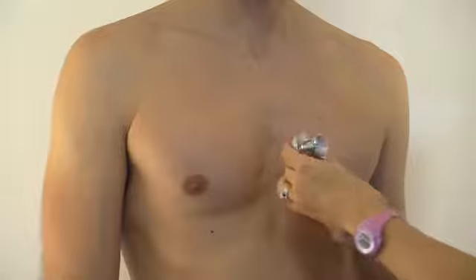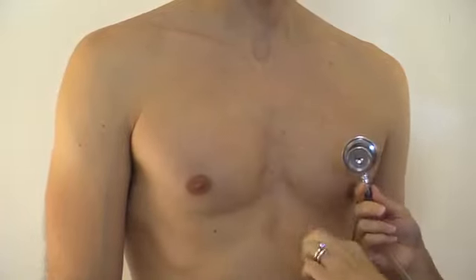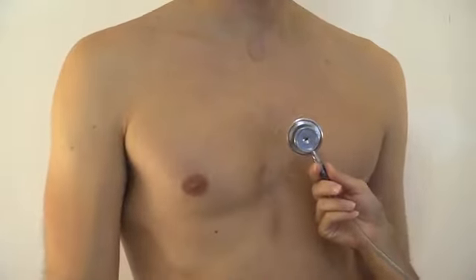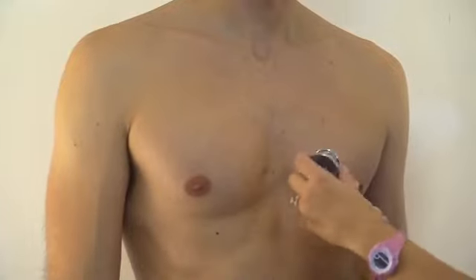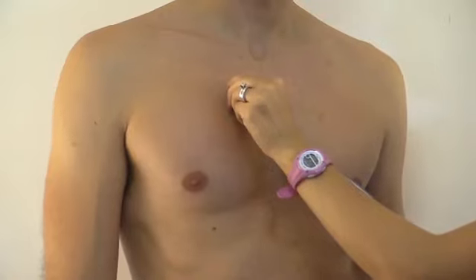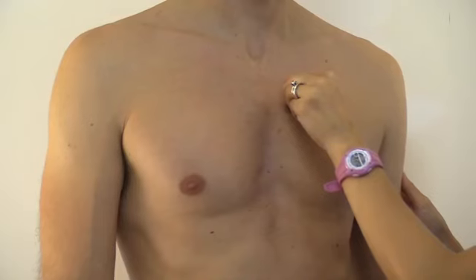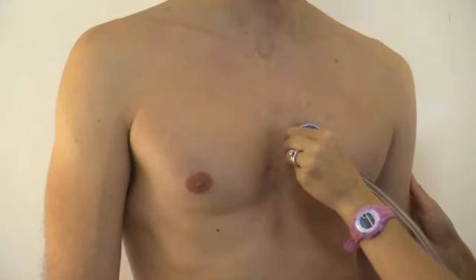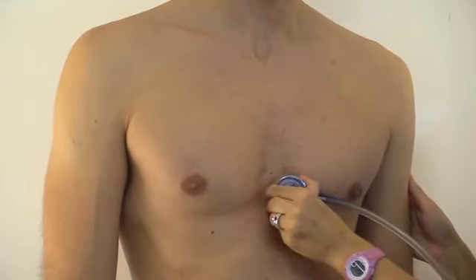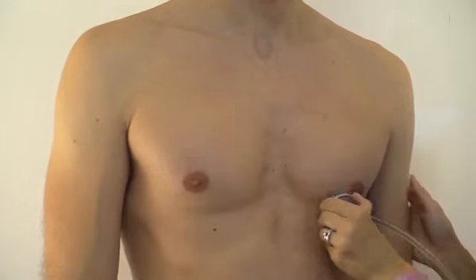Then we're going to switch over to the bell of our stethoscope and repeat in those locations, specifically listening for heart murmurs, that swooshing, blowing sound. And I did not hear any.